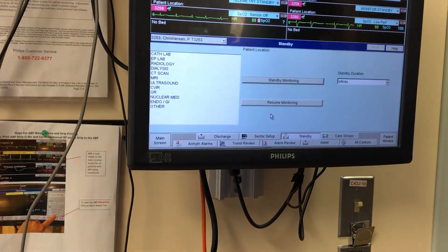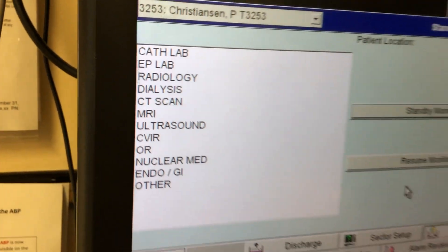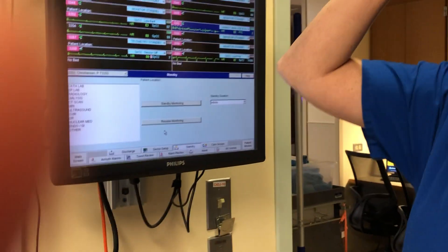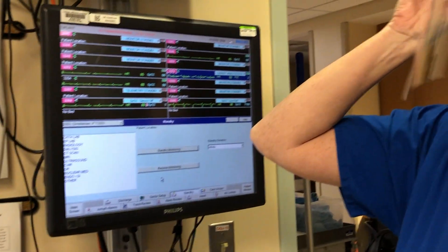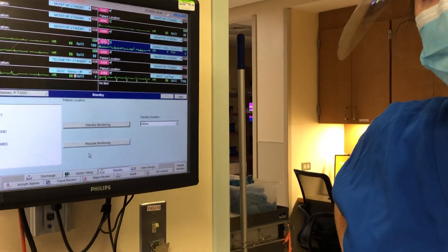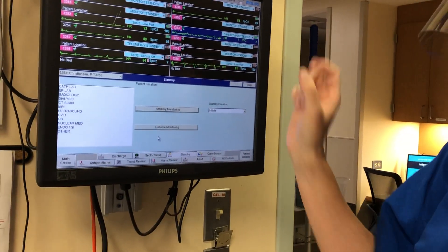Standby mode — we really only do that when the patient is leaving for a test, and you need an order that they can travel unmonitored. Otherwise we use tele packs. For OR cases, we take them down with the portable monitor and bring it back. Then put them on standby so you know they're on tele when they return.